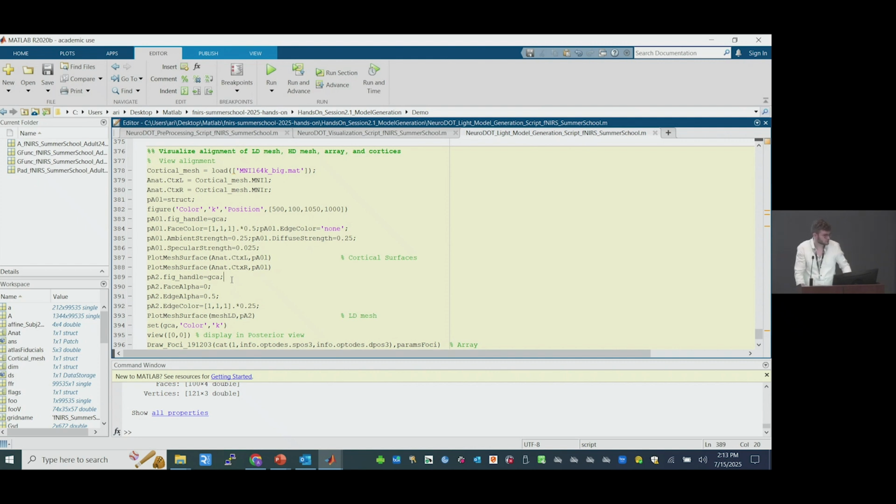Oh, we do have one more question? Yeah. From Zoom, someone asked, why did you choose to have more sources than detectors instead of the other way around? And is it because of cost or something else? That is a really good question. Unfortunately, I was not here when that system was built. So can I throw this to you, Joe? I have an answer. Thank you.